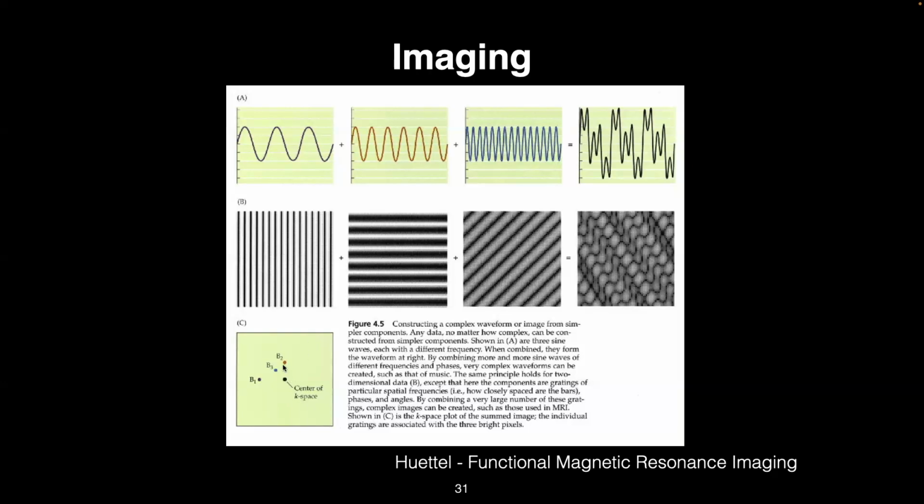Along Ky, whereas just B2, now we're varying in Y, and this is at a slightly lower frequency than B1 because you're not as far out. So this is a slightly lower pattern of spatial variation, but now in the Y direction. And then if you had something that's, say, 1 unit out in X and 1 in Y, then you're varying along both axes simultaneously, but along this diagonal. When you add these together, you get something that looks like this. But the Fourier analysis allows you to go back and forth between these two domains losslessly. These are equivalent representations of information.